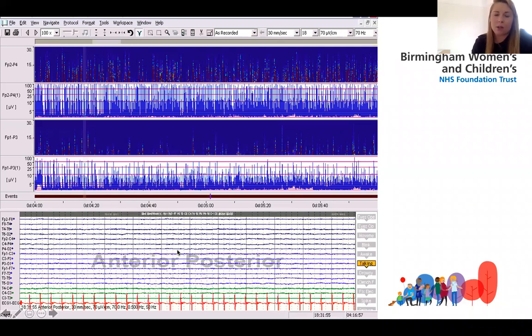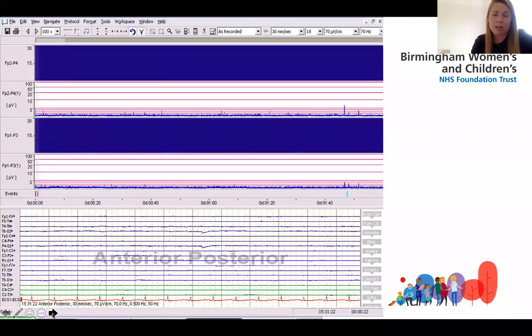their thiopentone cutting back, despite the fact that actually we can still see there's a very small seizure happening down here. But if the thiopentone isn't weaned or is increased, we can force this into an isoelectric EEG, which we really want to avoid. So it's just important that you follow the seizure pathway and that you think about the use of thiopentone carefully.